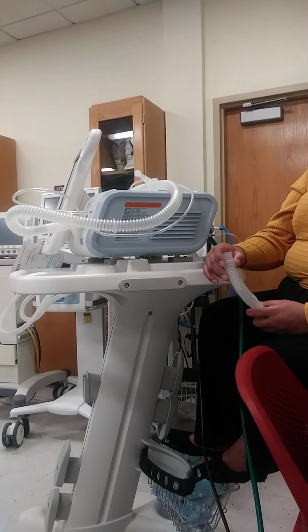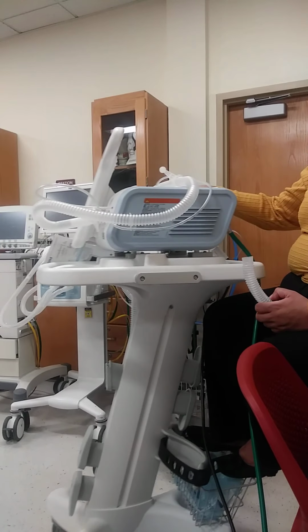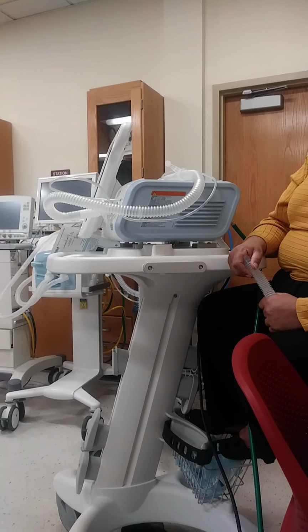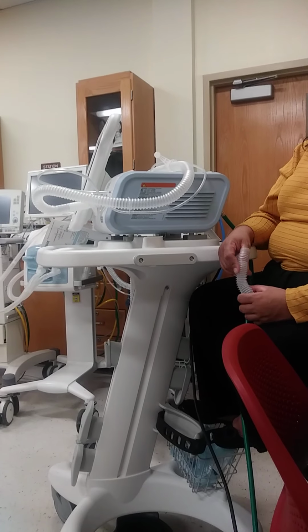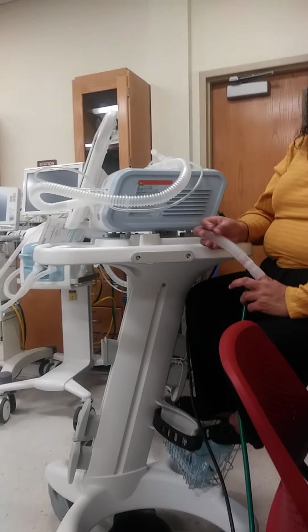Excess gas, air. If I don't know how to use my pressures correctly, I can actually cause a pneumothorax. I can cause hemodynamic instability, like maybe arrhythmias, with that pressure. Those are your big hazards.